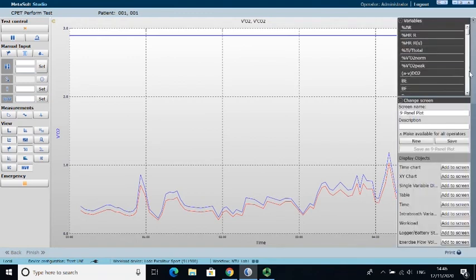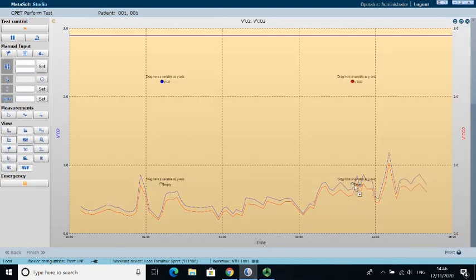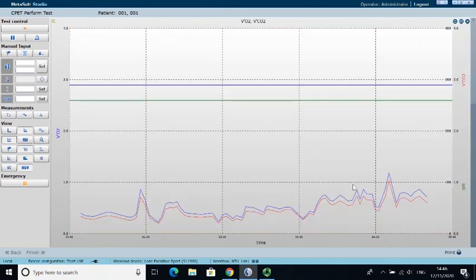What we've got here is something simple: a resting oxygen consumption which sits in and around 0.3, 0.4, with some variation, just because it's breath by breath data. Then at the 3 minutes, if you remember, we got them to start doing some unloaded cycling. Now we can see that those numbers have increased a little bit to more like 0.5, 0.6, maybe even 0.7, and they're reasonable values for unloaded cycling. There's still an amount of work required just turning your legs over even against no resistance, and that's what's being reflected here. If you think about it, you turn your legs around, you still need more ATP, so in order to resynthesize that ATP, we're still going to need a little bit more oxygen, and that's what you can see.